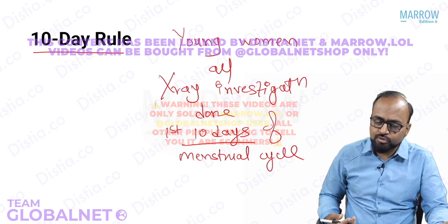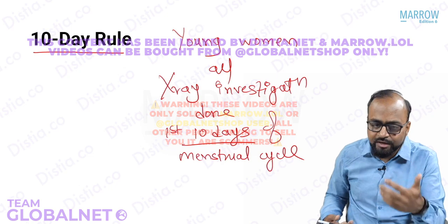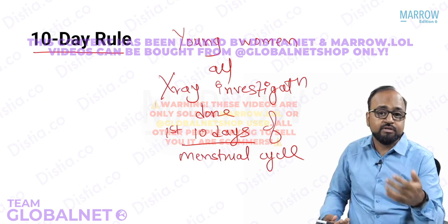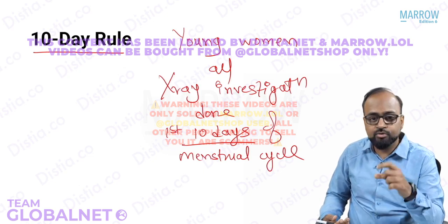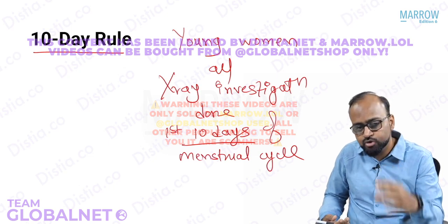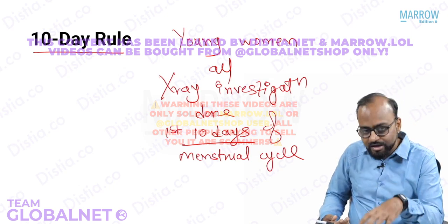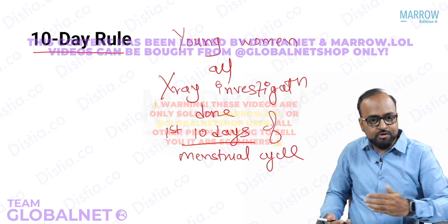Right now, what is usually followed, instead of an empirical rule, is that all technicians are trained to inquire with the patient before doing an X-ray whether there could be a possibility of the patient being pregnant. This question has to be specifically asked, and only when we've ensured that there's no possibility of pregnancy can an X-ray exposure be done anytime throughout the cycle. Otherwise, empirically, this was called the 10-day rule, and therefore this question was applied.